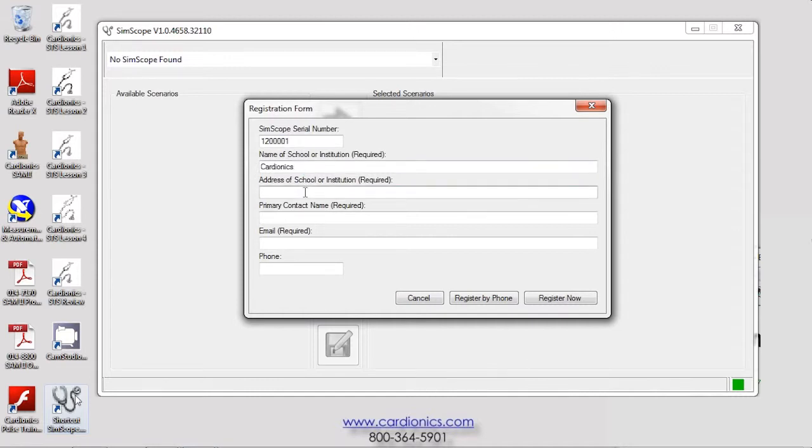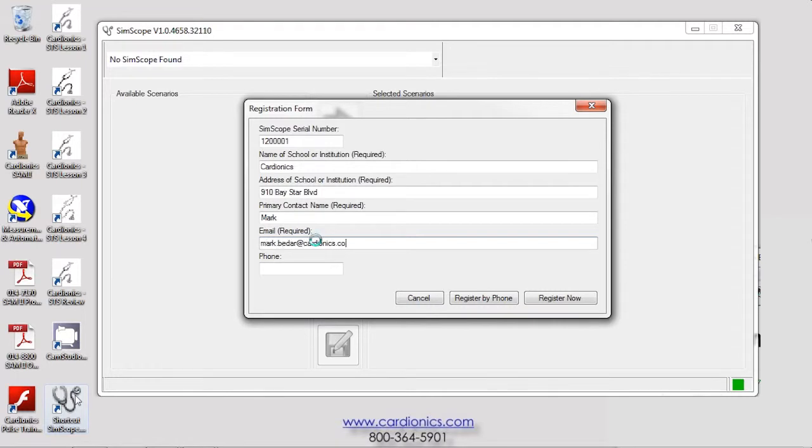For computers connected to the Internet, the information is registered instantly. If you are unable to connect to the Internet, click Register by Phone and follow the instructions.